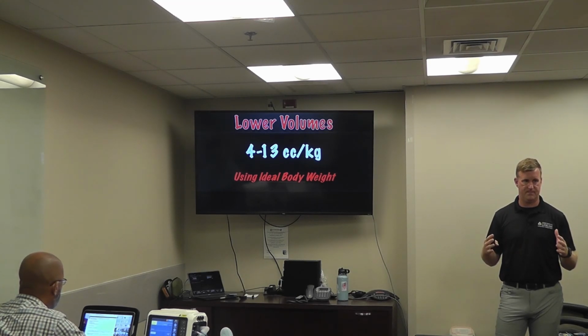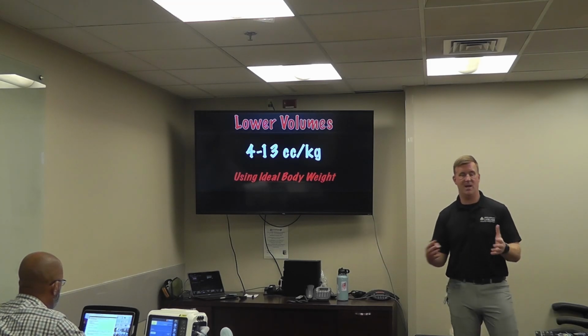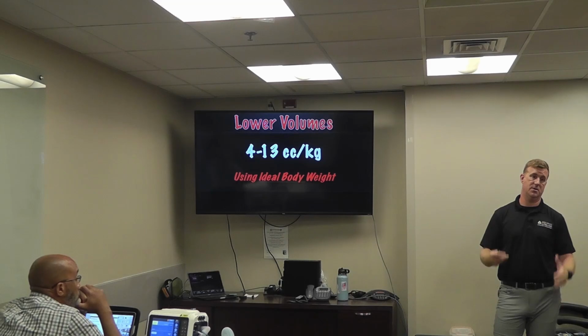Does that make sense? So we can take advantage of their big lungs to get them a minute ventilation that's appropriate by letting them exhale, giving them a nice long time to exhale.